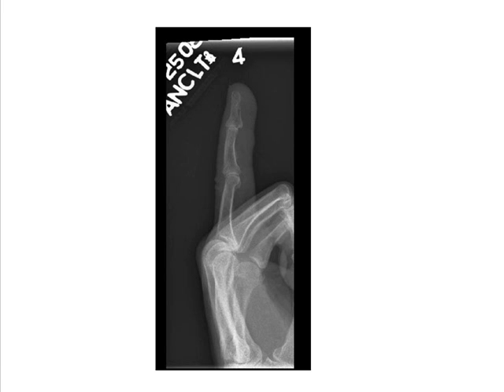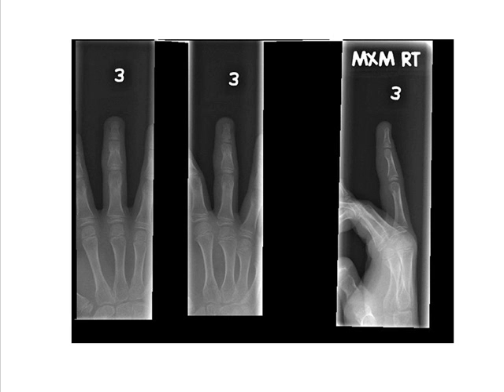The lateral digit radiograph should demonstrate the entire digit with unilateral concave anterior surface of the phalanx and the fingernail in profile. Appropriate contrast and density will demonstrate both soft tissue and trabecular detail of the bone.